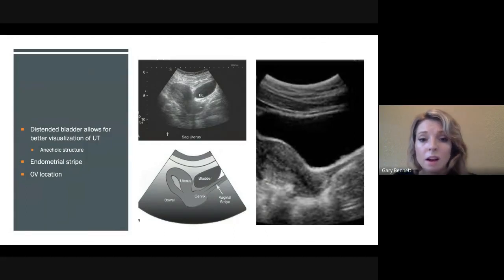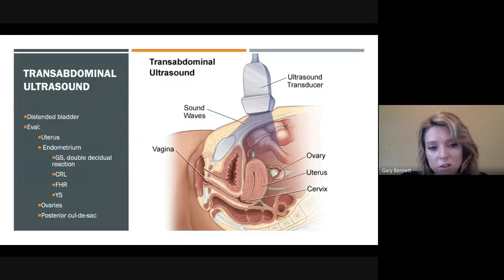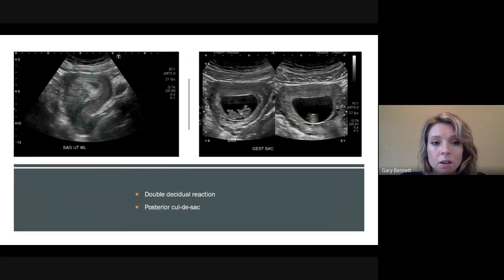These are some helpful slides. I think you guys have this PowerPoint from last time. I would suggest familiarizing yourself with what is normal, just because it's going to make it so much easier to recognize some abnormalities when you're used to the normal appearance.